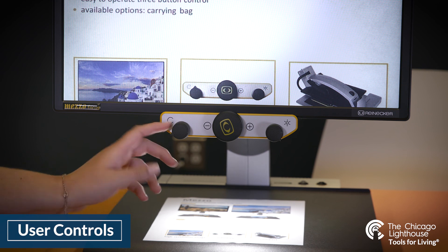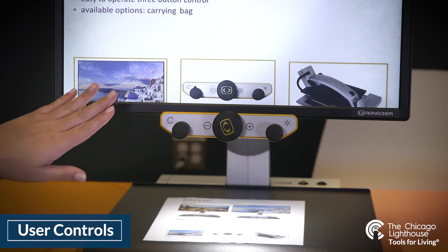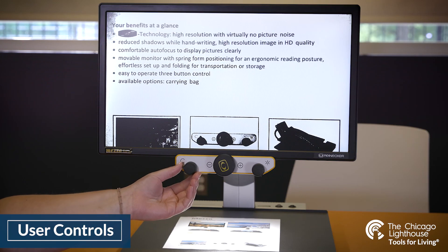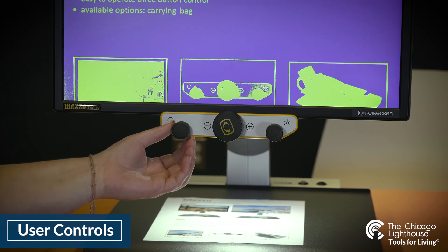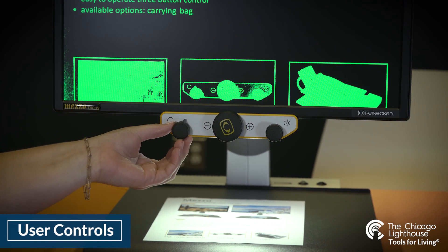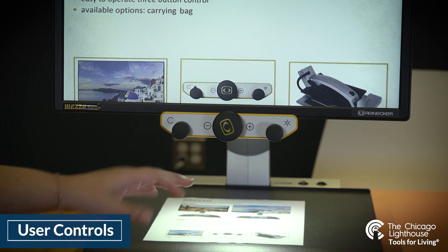On the left dial, when we turn clockwise there are six available positions. The first one is full color. Turning clockwise we go to black text on a white background, next white text on a black background, green text on a black background, yellow text on a black background, and yellow text on a blue background — just to show all of those colors slowly as we go back to full color.